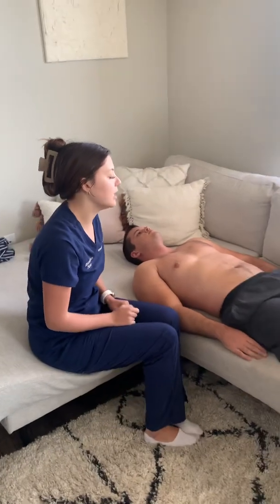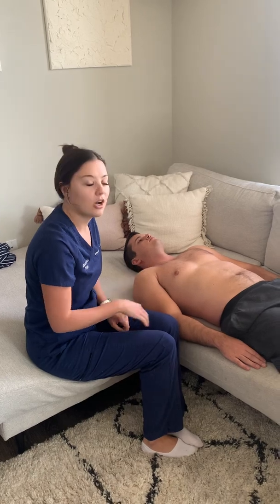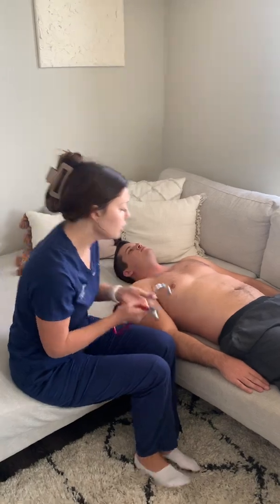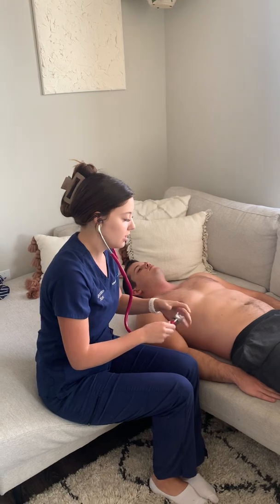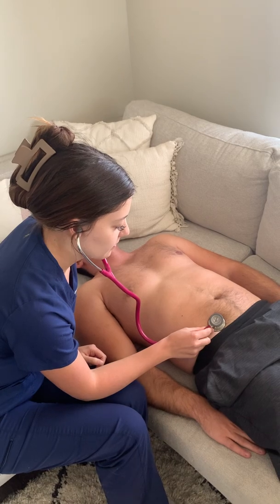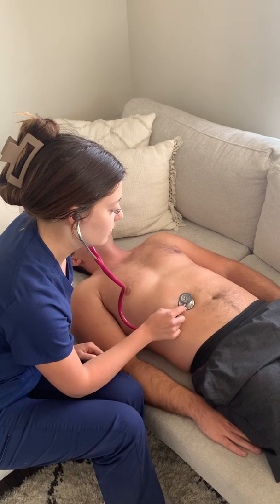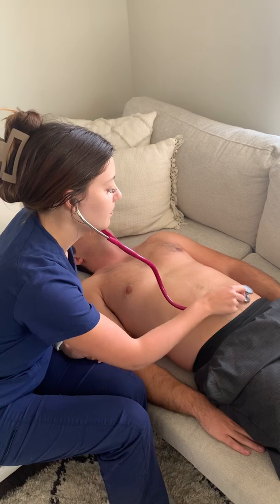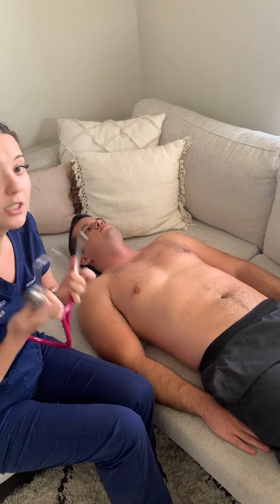The next thing I'm gonna do is auscultate. I'm gonna listen for bowel sounds in all 4 quadrants. And then I'm going to auscultate for bruits in the various arteries within the abdomen. So I'll listen to bowel sounds with the diaphragm on my stethoscope. And I'll start in the right lower quadrant and move in a clockwise direction. Great. Bowel sounds are normoactive to all quadrants.